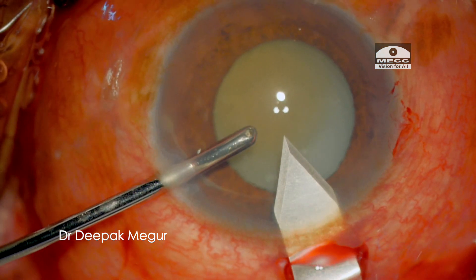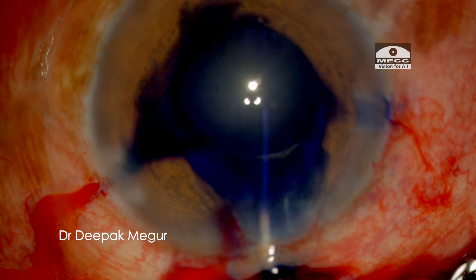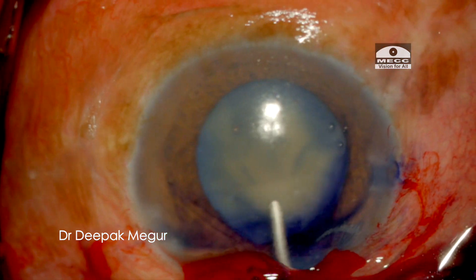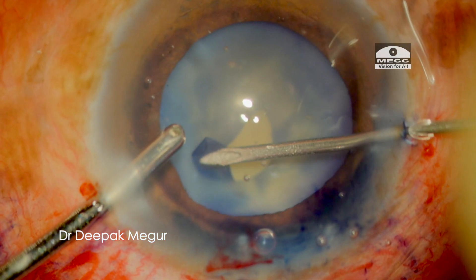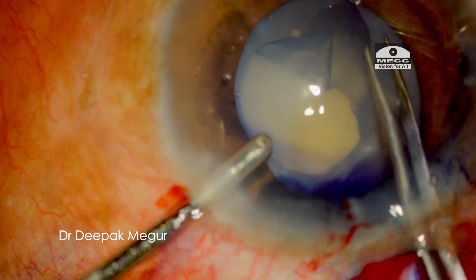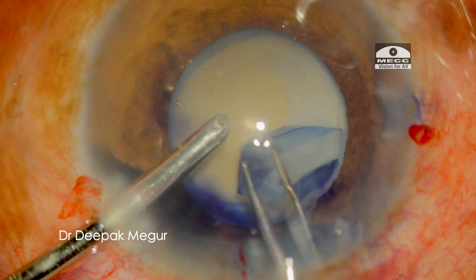After creating the main incision, I stain the anterior capsule with trypan blue. The capsulorhexis is now being performed using forceps. The zonules seem to be of reasonable strength at this stage, as I am not noticing any capsular fold during the rhexis, and the tearing is also quite seamless.